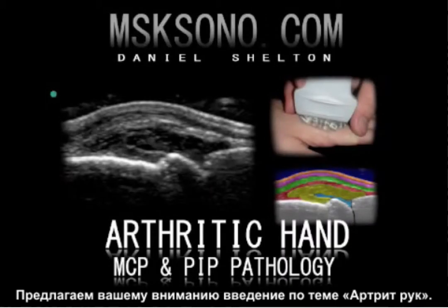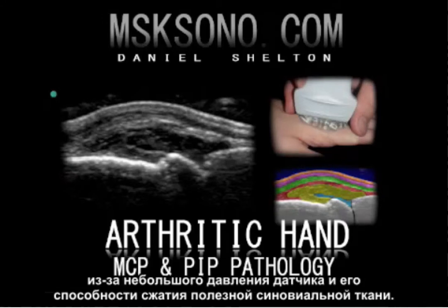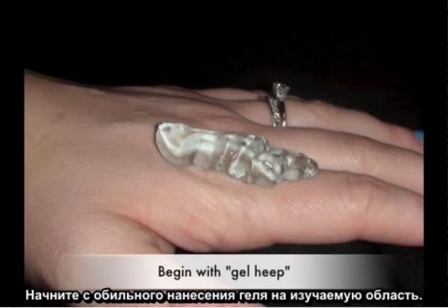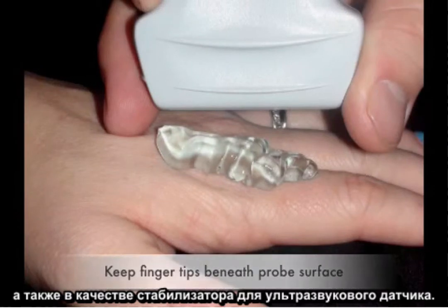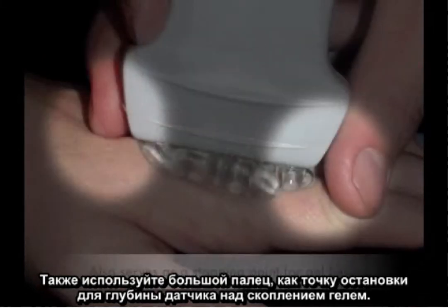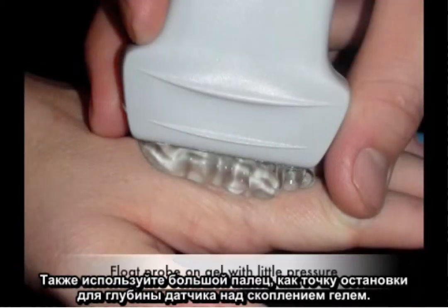The following is an introduction to the arthritic hand. Scanning technique is of particular importance while scanning the metacarpophalangeal joints or the proximal interphalangeal joints, due to the slight transducer pressure and its capability of compressing useful synovial tissues. Begin with copious gel heaping over the area of interest. First, utilize the index finger as a primary palpation point as well as a stabilizer for the ultrasound transducer. Also, use the thumb as a stopping point for the transducer's depth over the gel heap.